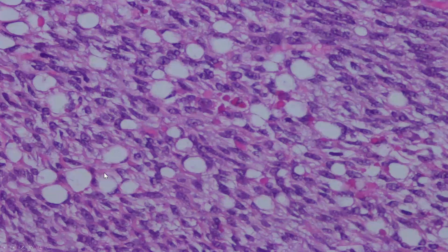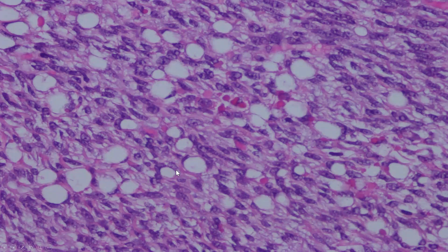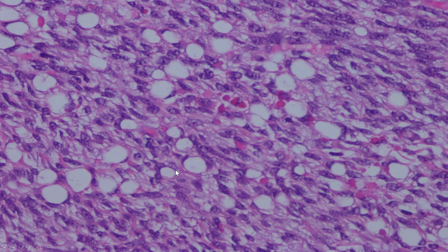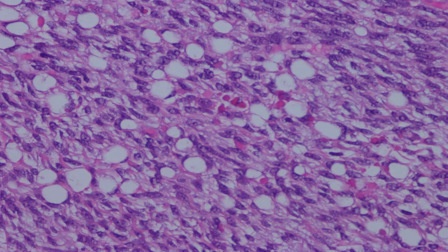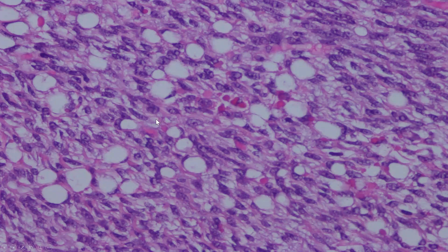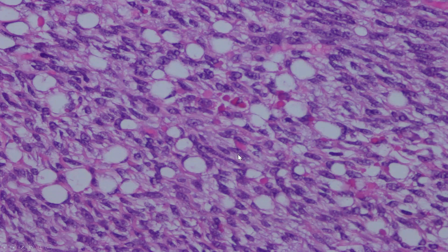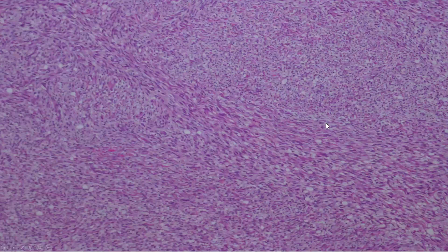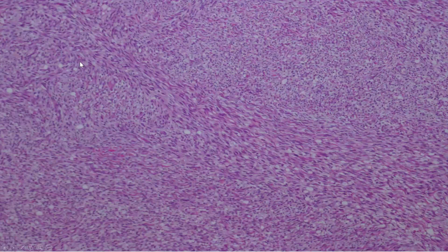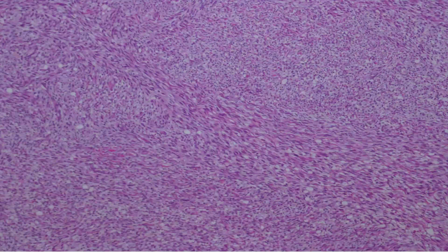Another focus within the tumor again shows these cells with a signet cell appearance resembling carcinoma of the stomach that is known to metastasize to the ovary. The background shows this spindled cell proliferation, and we also have those globules.